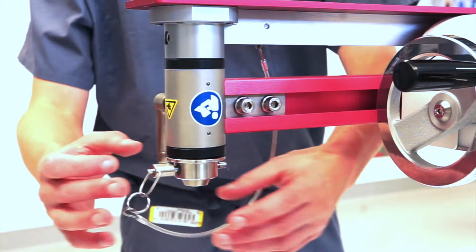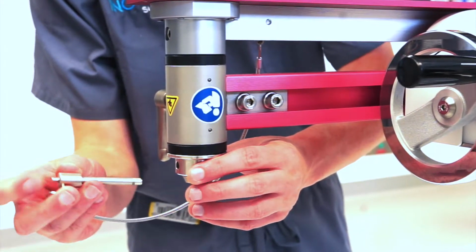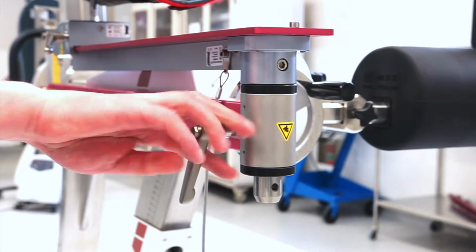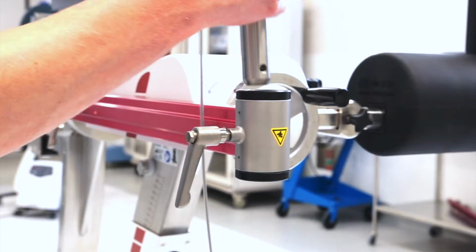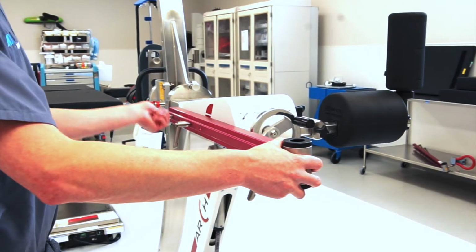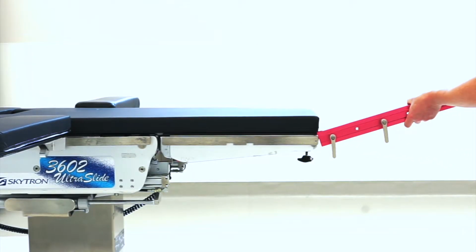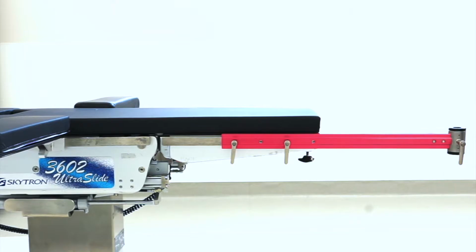To remove the OLH from the arch, push the button on the end of the pin and remove the sleeve. Loosen the lever, then remove the extension deck from the extension rail and set it aside. Remove the extension rail from the storage rail. Slide the extension rail onto the non-operative side OR table side rail.